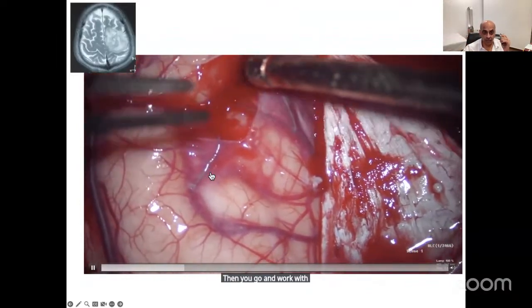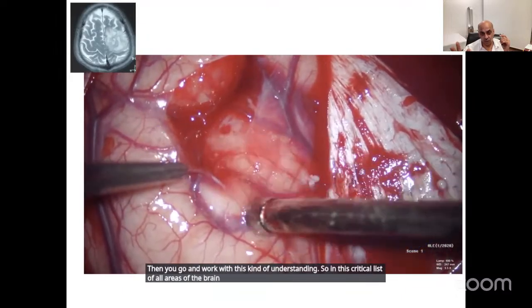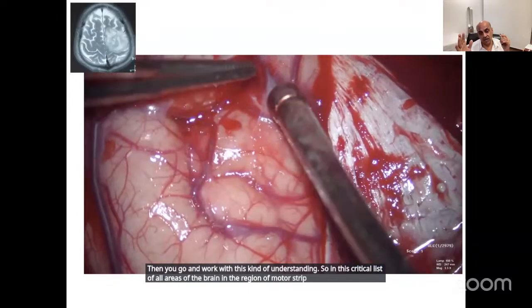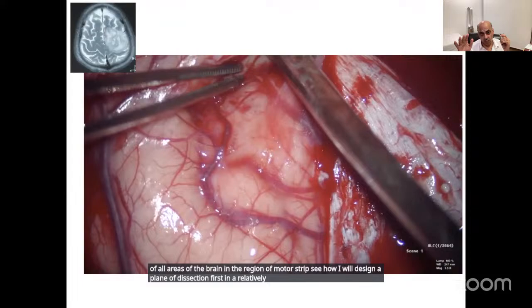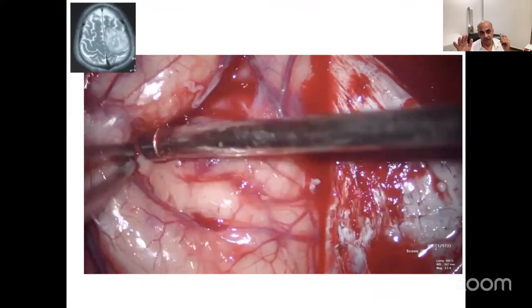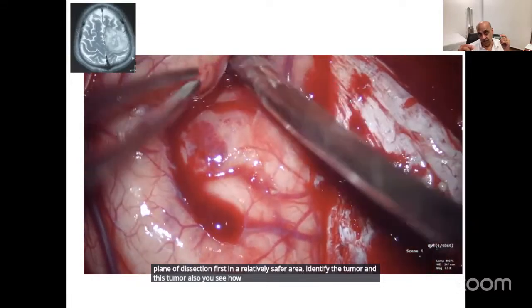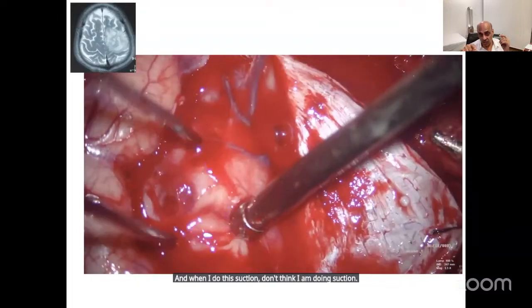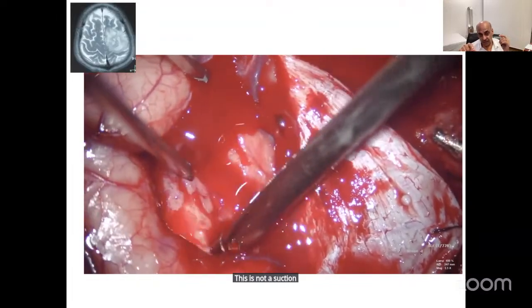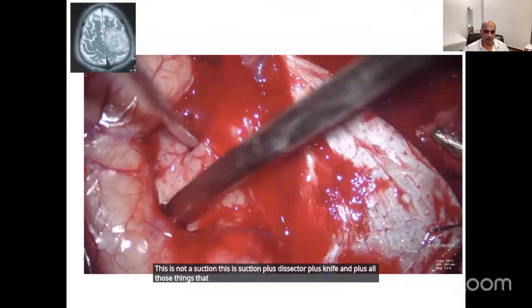So in this criticalest of all areas of the brain, in the region of motor strip, see how I will design a plane of dissection first in a relatively safer area, identify the tumor, and this tumor also, you see how, and when I do this suction, don't think I am doing suction. This is not a suction. This is suction plus dissector plus knife and plus all those things that you can imagine in neurosurgery.